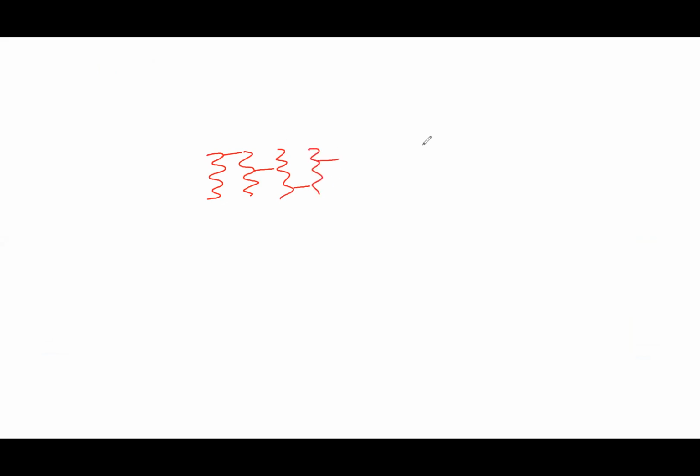The stent is something like this, if you see the stents, and they have links in between. These stents are cut by laser of a slotted tube. Like there's a tube like this, and the laser cuts stuff in it and makes this kind of structure.